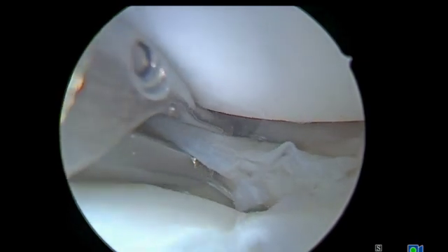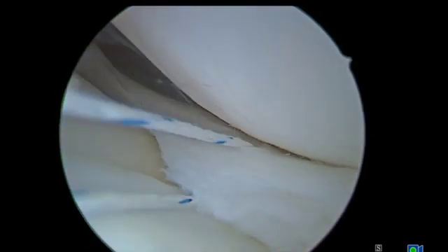Using a Smith & Nephew Nova Stitch Pro as an all-inside device, a single traction suture was placed to aid in reduction of the tear throughout the case. Here the traction suture is shown reducing the meniscus.